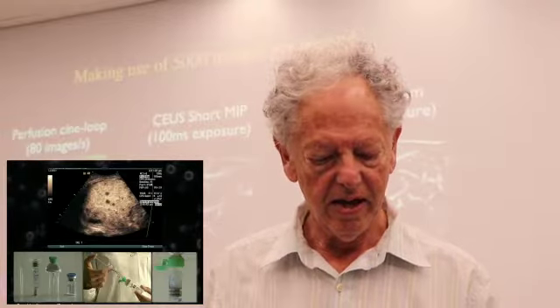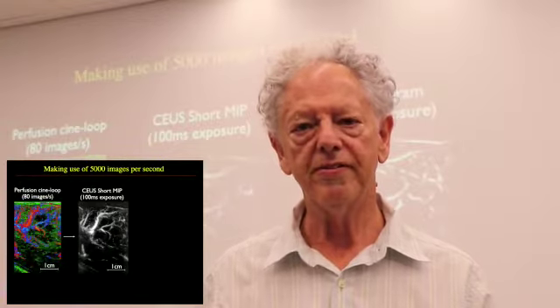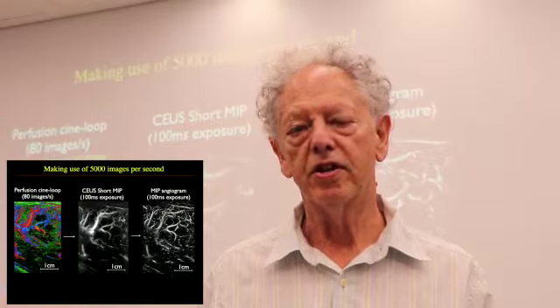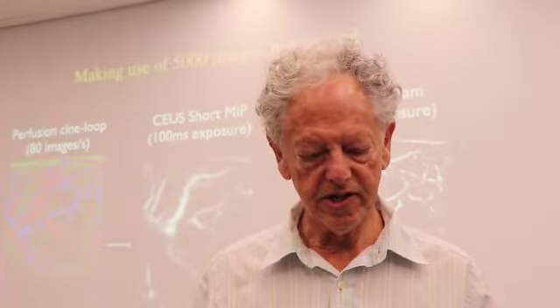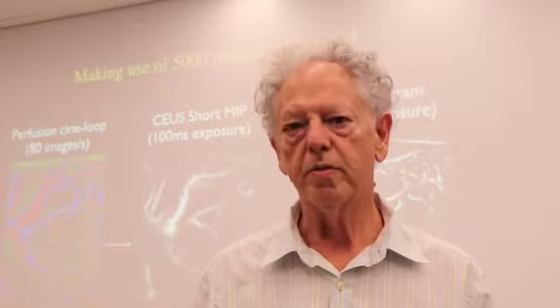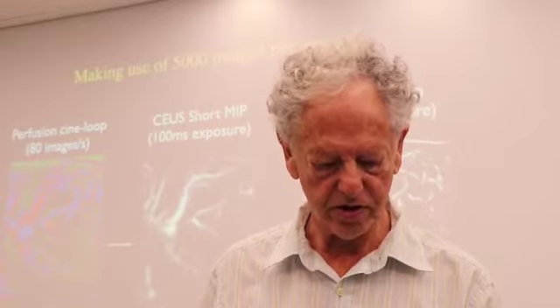But if we combine this with the high-speed technology that we are developing, then we can take the kinds of image you see in colour on the left and deduce from it the microvasculature, invisible at the moment to modern radiology, but this technology is able, with the aid of a computer, to track the path of bubbles and map the tiniest blood vessels. And this will improve the resolution and the ability to see very small vascular structures in the body.